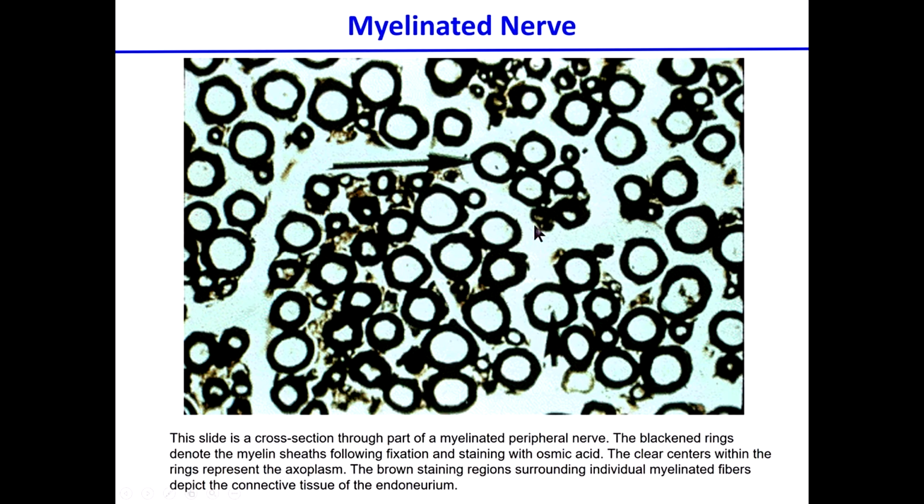And as far as I know, the person who did this slide has been very good at showing myelinated portions. And we cannot deny that maybe somewhere in between there is another node of Ranvier that, because it didn't stain, we cannot see. All right? But this is a transversal section of many myelinated neurons. The inside of each of those little circles is the axoplasm, the axon is in there. Questions?